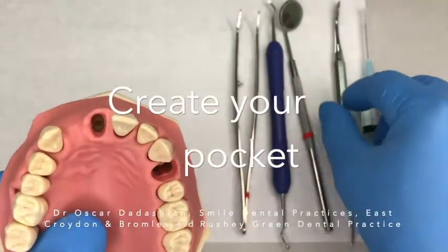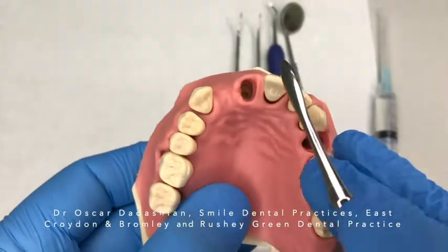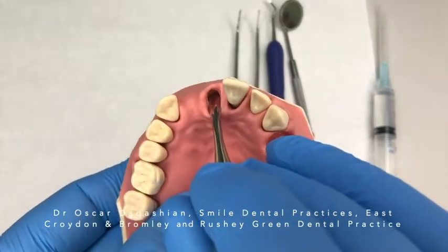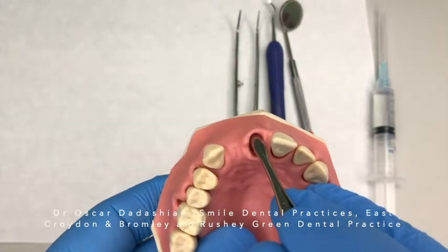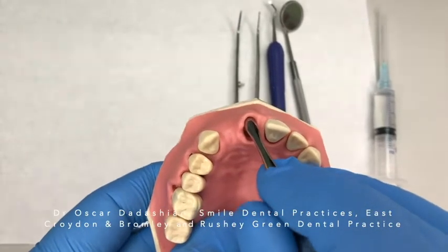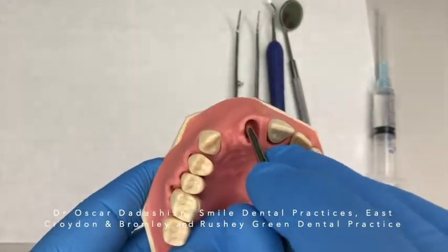Now we want to create a pocket between the bone and the soft tissue, and for that you use your mucoperiosteal elevator. Use the narrow sharp end of your mucoperiosteal elevator. Go to the bottom of the socket and come up to find the bony lip, the bony crest, and very gently, once you find that, start going beyond it and undermine that soft tissue away from the bony crest.